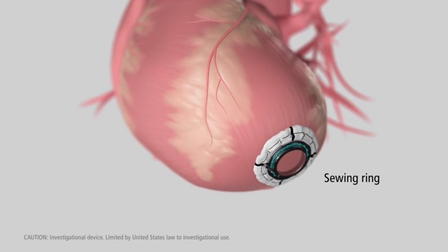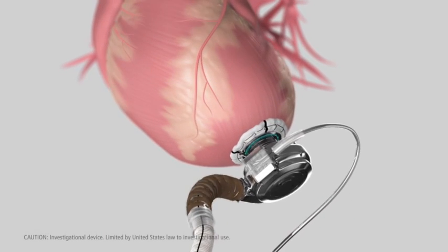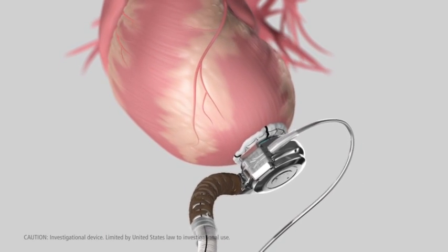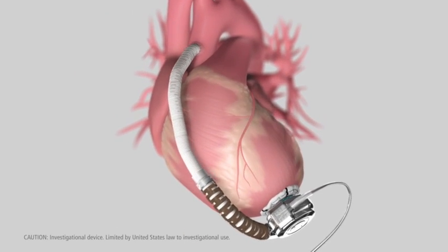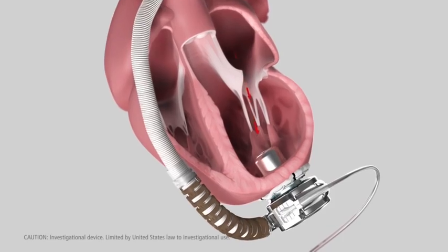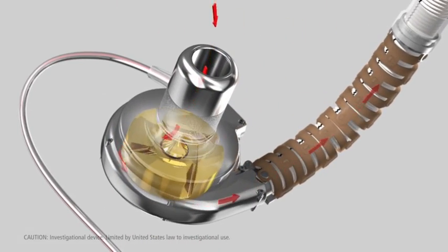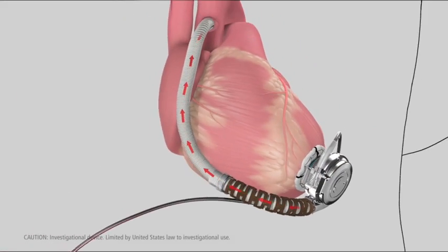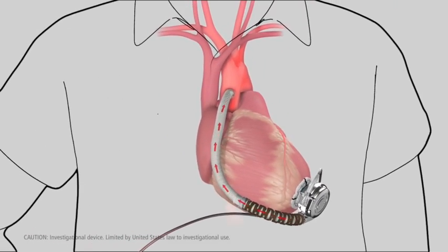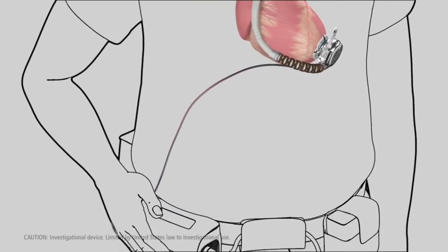Its small size and integrated inflow cannula allow the device to be implanted completely in the pericardial space directly adjacent to the heart, thereby avoiding abdominal surgery. The implant procedure makes use of a proprietary sewing ring and custom apical coring tool, which allow the pump to be attached to the apex of the left ventricle. The outflow graft is then attached to the ascending aorta.